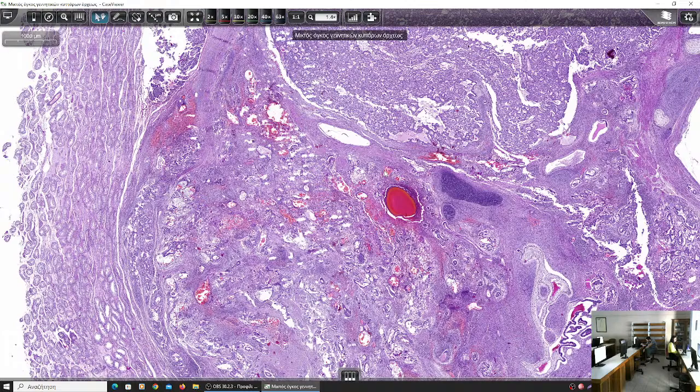So these were the germ cell tumors of the testes, which as a rule are chemosensitive, and this is a field that oncology can give therapy to the patients and not just a prolongation of the survival period, such as in other tumors. So that was the first part of our lesson today.